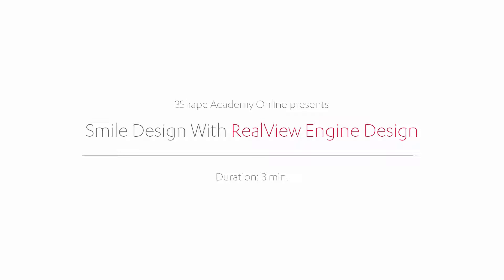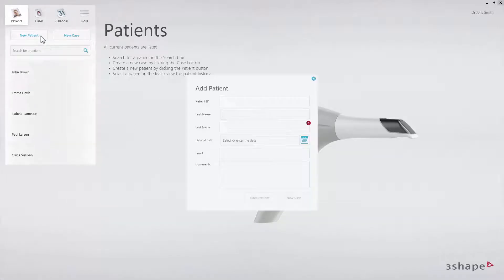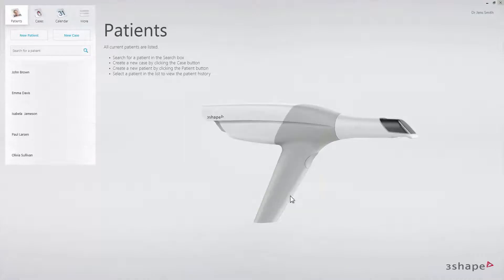While watching this video you will learn the workflow for the Smile Design application, followed by the RealView engine design. The workflow starts by creating a patient and a case in the 3Shape Dental Desktop application.